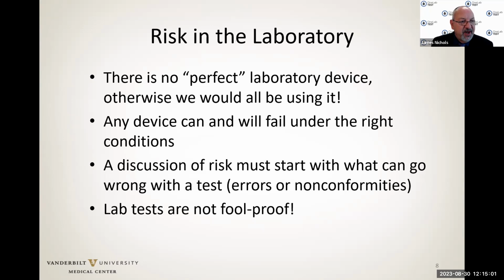Any device that we have, any test can, and it absolutely will fail if it's used under the right conditions, or what I will say, the wrong conditions. A discussion of risk, therefore, has to start with what can go wrong with the test. Where are the potential for errors and nonconformities? Lab tests essentially are not foolproof.